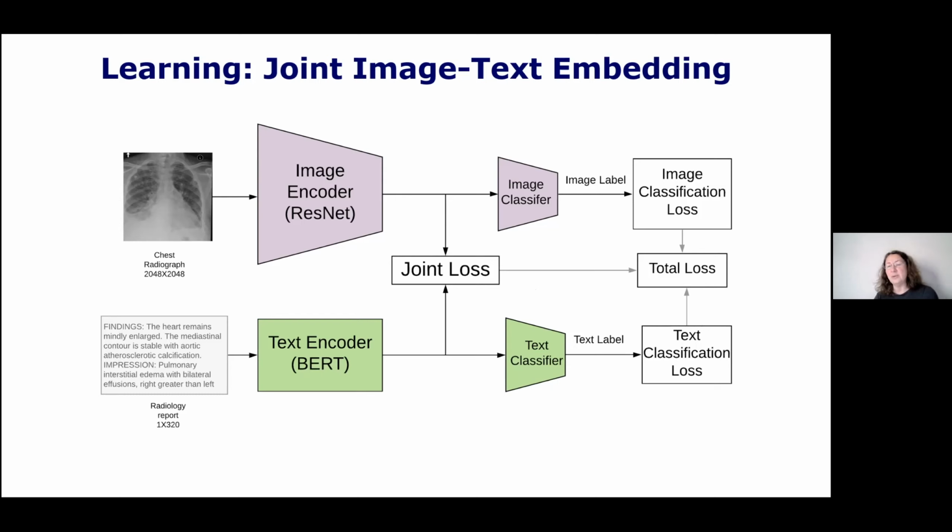So the system is trained together, meaning that the classifiers and the embedding and the encoders are trained together. And so the classifiers are encouraged to perform well on the task at hand, meaning to classify labels or radiology reports, while encouraging the structure in the internal space that represents both images and reports. And so the preliminary version of this work was presented at MICCAI in 2020.